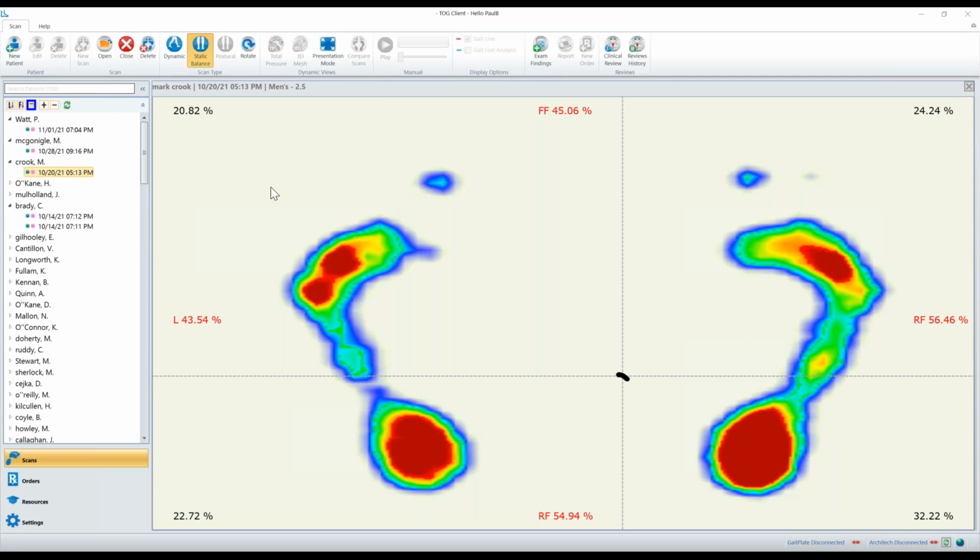It's very important that if you are going to put this patient into an orthotic down the line, that you do address that. Because if you put a patient into an orthotic but don't address the fact that their posterior compartment's tight, their foot will try to pronate heavily against the insole. And the insole will feel either too high, too hard, it will blister the arch, and it will feel uncomfortable.